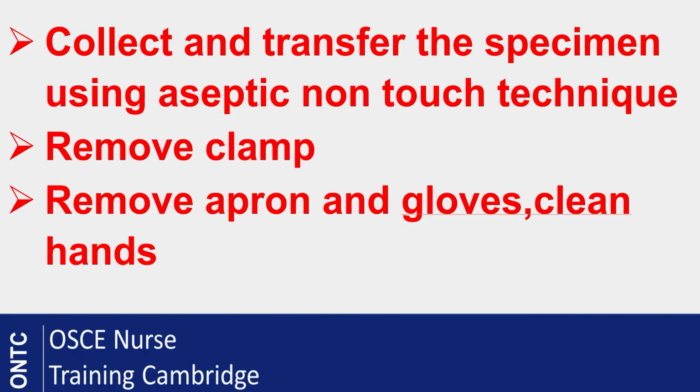Okay, and then you're going to insert the syringe into your port. In your exam it's usually a needleless port, so you will not need to use a needle. You will go straight into your port, and then you're going to collect about 10 mils of your sample. You're going to transfer aseptically. It means not touching anywhere outside of your bottle, and also inside.